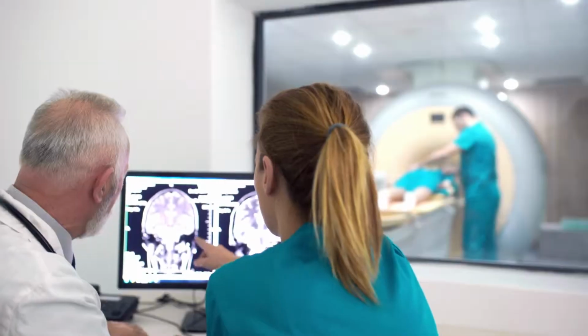The problem is that it doesn't give us a lot of detailed information about what causes people's pain or disabilities, and therefore we commonly have to go to a more advanced imaging technology to answer the real clinical questions. And the next most important one really is magnetic resonance imaging. This has been around since the late 1980s. And magnetic resonance imaging has some decided advantages over regular x-rays.